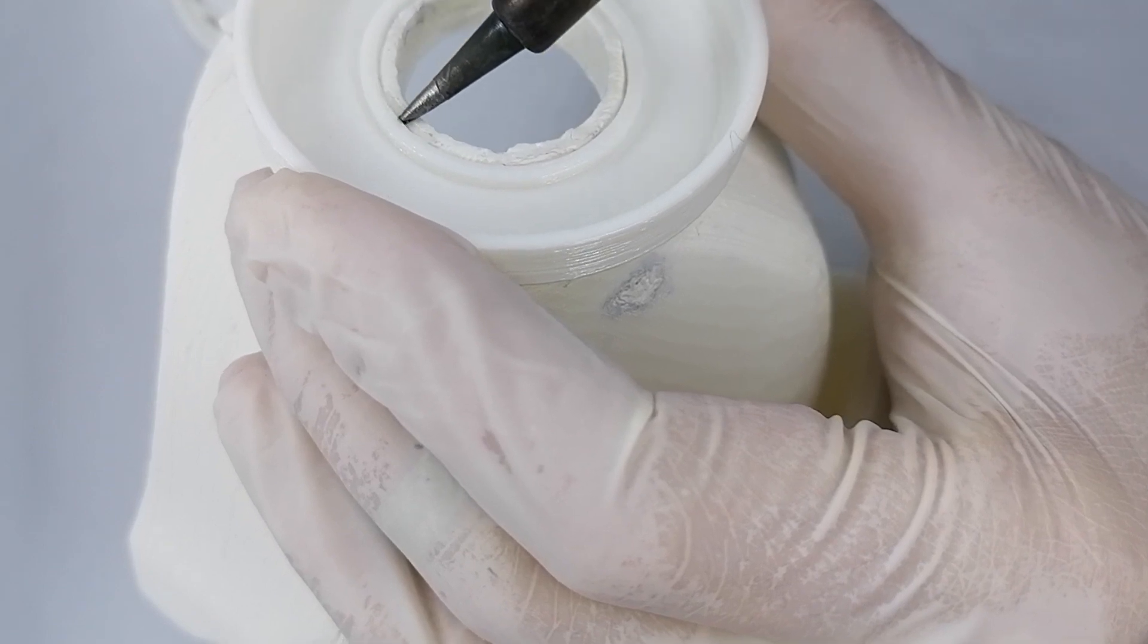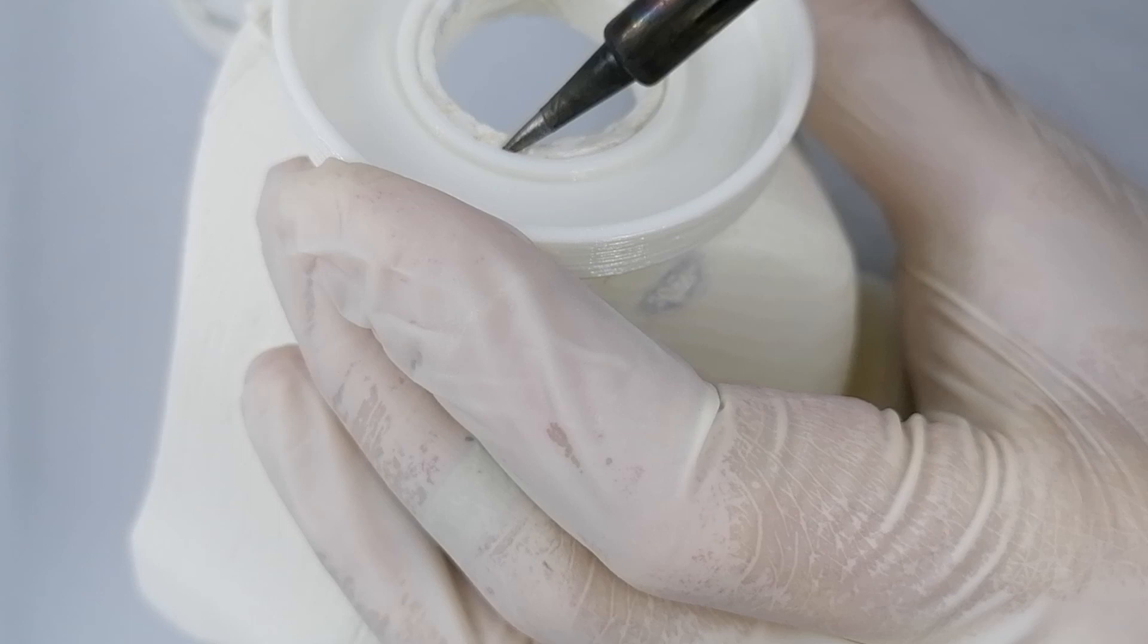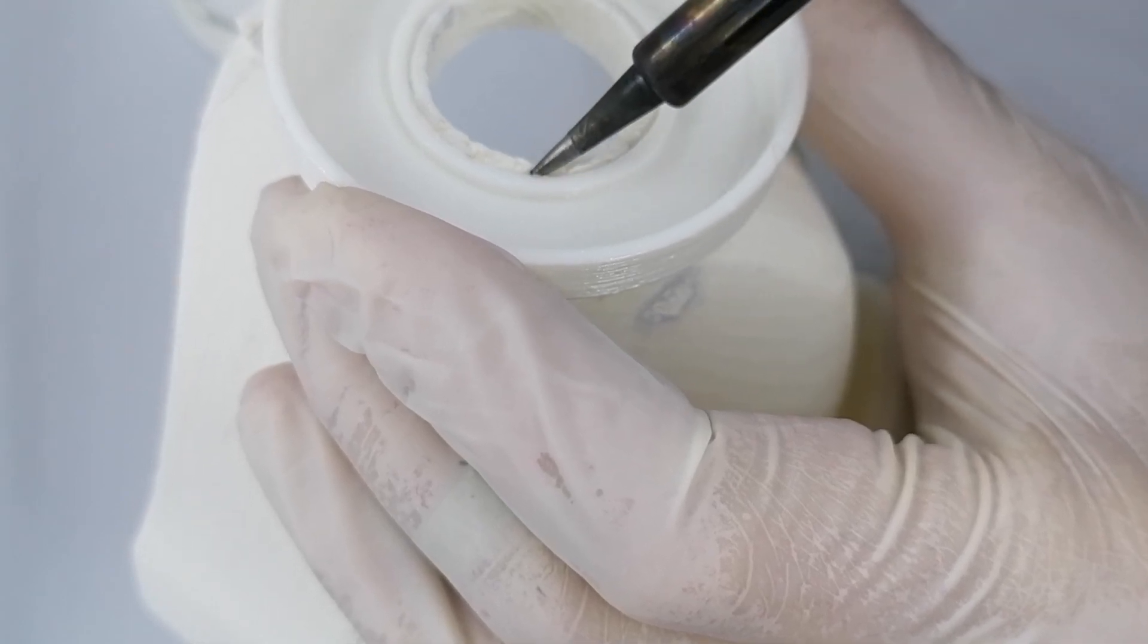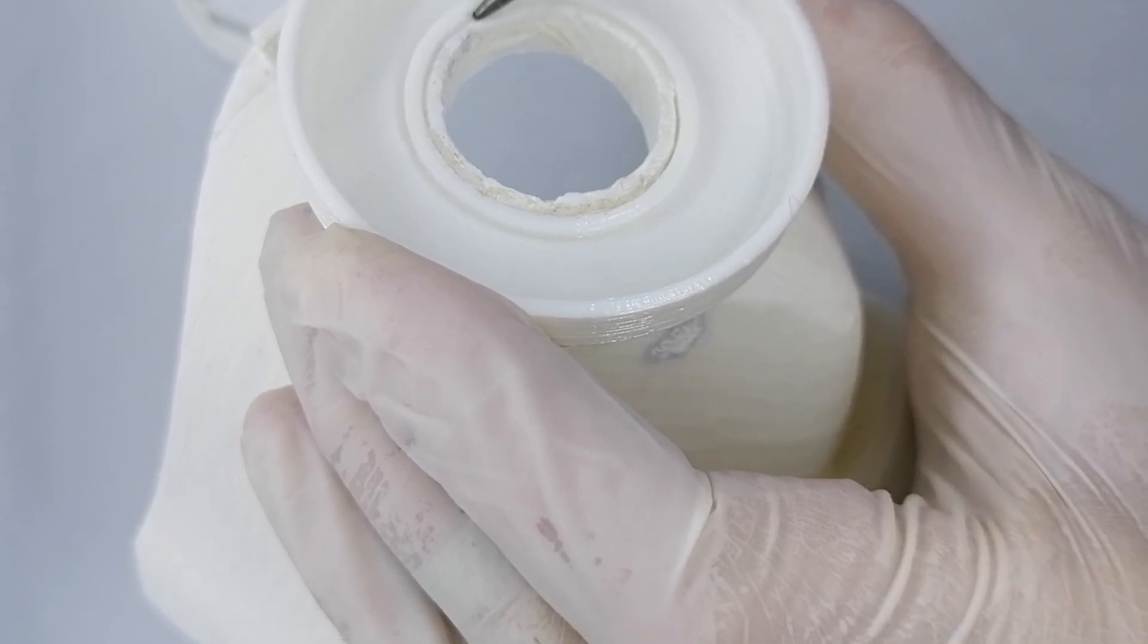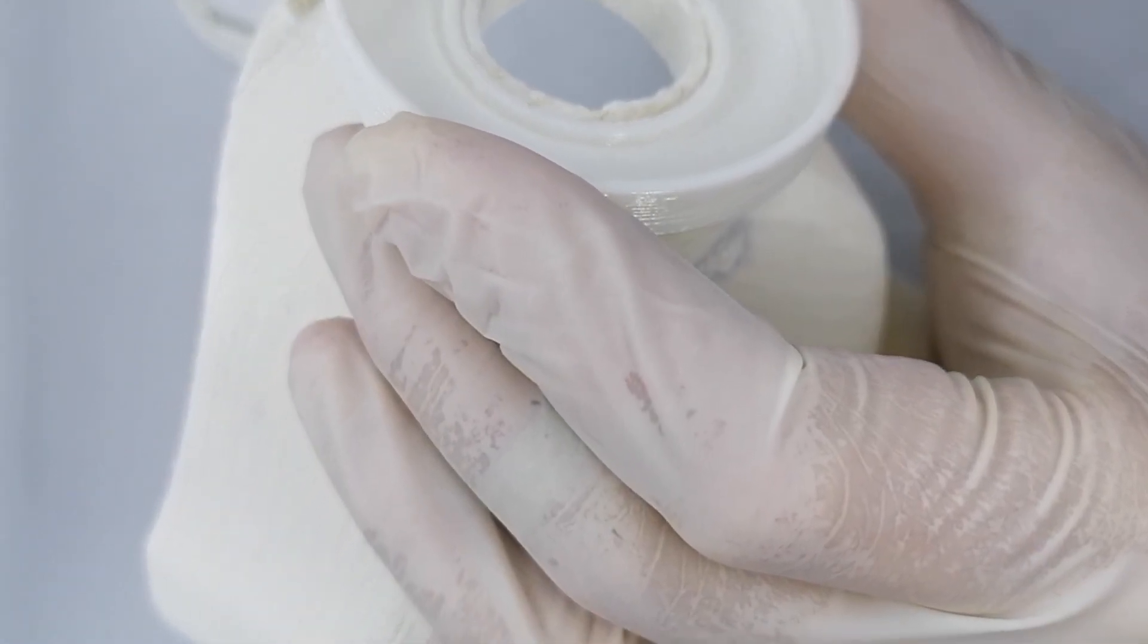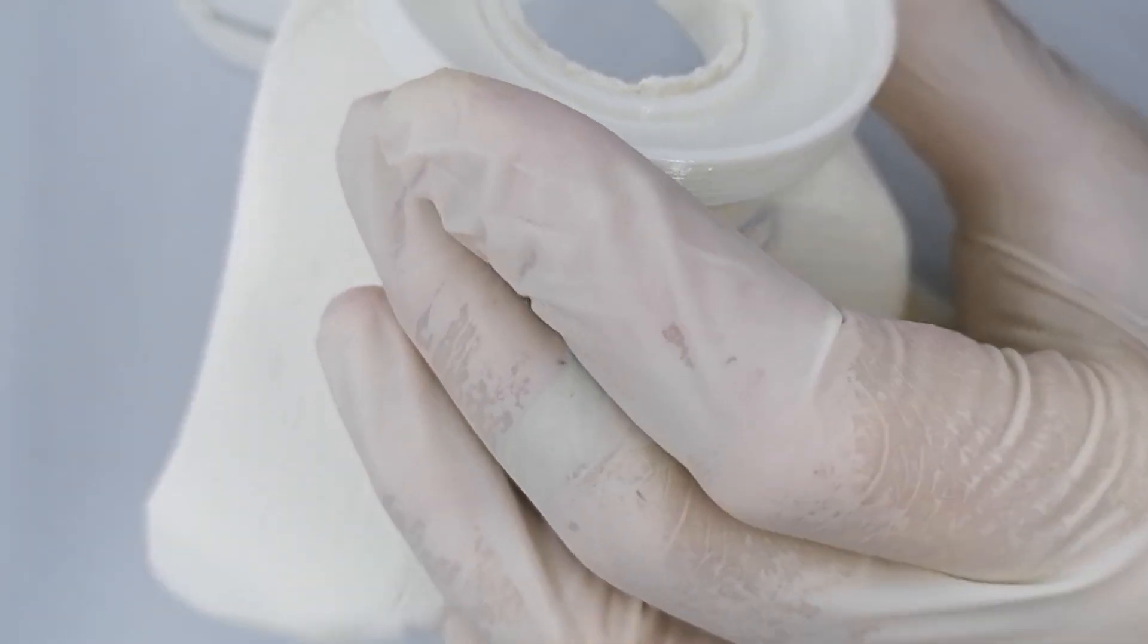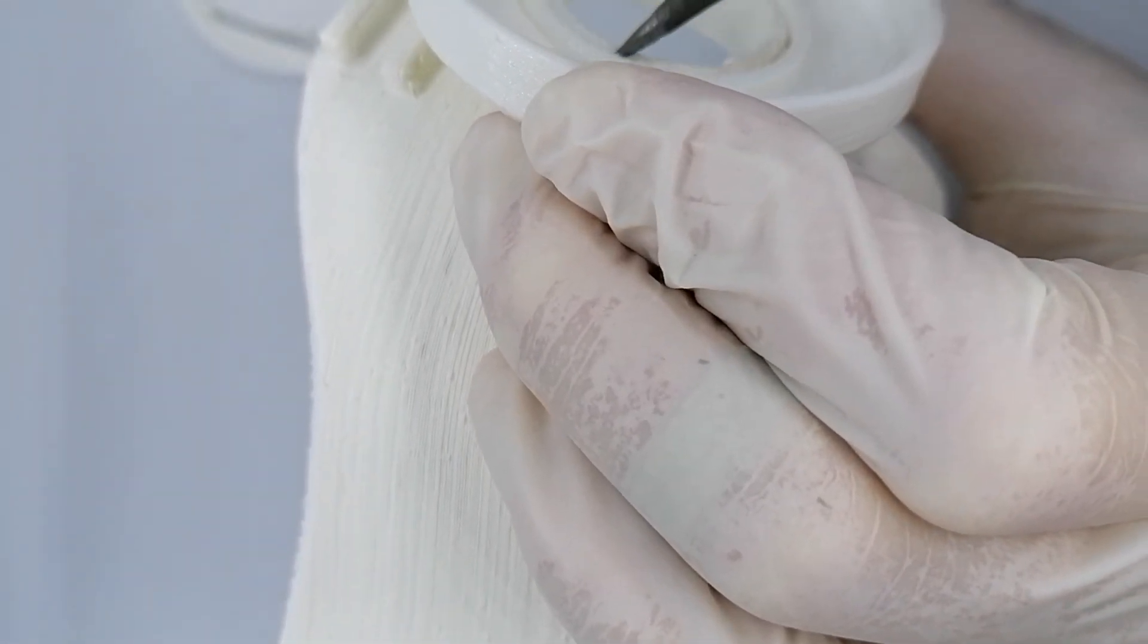I just set my soldering iron on 300 degrees because this plastic is PLA. And melting it a little will just join the two parts enough so the filter won't fall off.